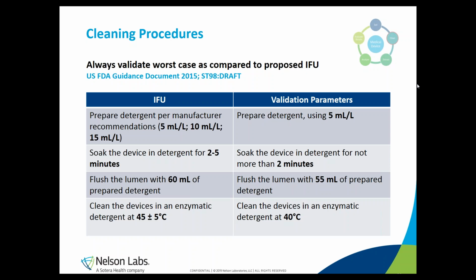When we design a cleaning procedure at Nelson Labs, we will always tend to test in a worst case scenario. That means that we, for example, take the lowest allowed concentration of a cleaning agent, or the shortest soaking time for the device. Flushing volumes will be chosen just under the minimum volume recommended in the instructions for use of the manufacturer. And enzymatic detergents are used in certain temperature ranges in order to be active, so we choose to use, for example, the lowest allowed temperature in our cleaning validation process.